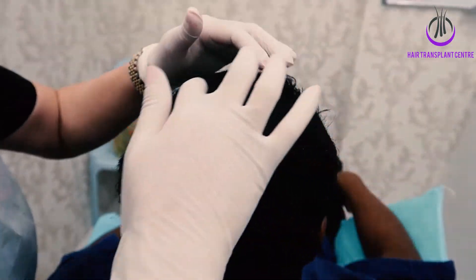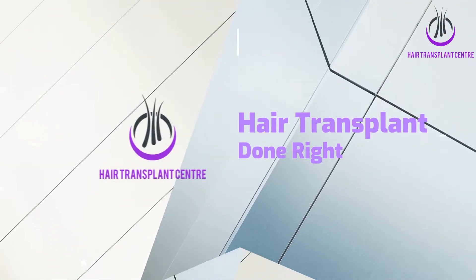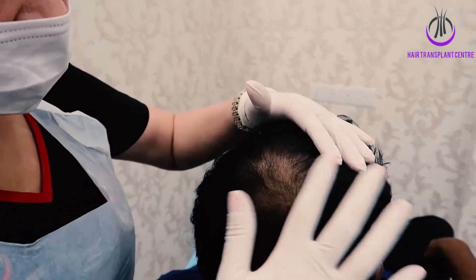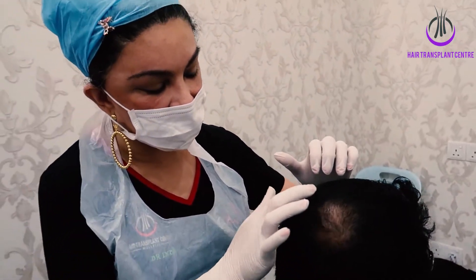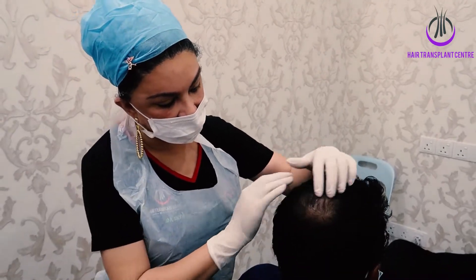Today it's a crown area hair restoration FUE. You can see there's a loss of density in the crown area. The angle, direction and distribution will be following your original hair here — you can see — so it will be very natural.